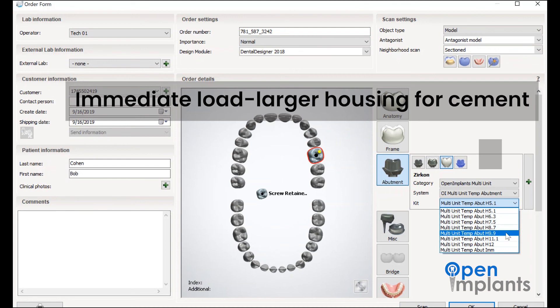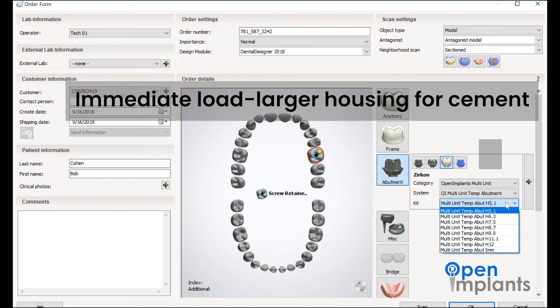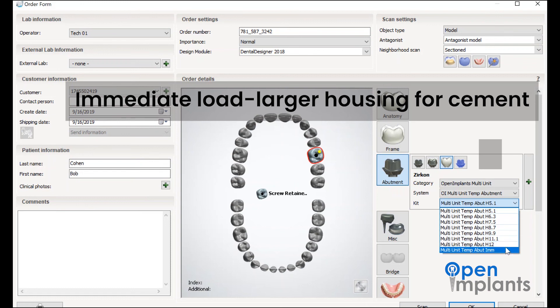The very bottom is for immediate loads. It will give you more space between the titanium base and the final crown.